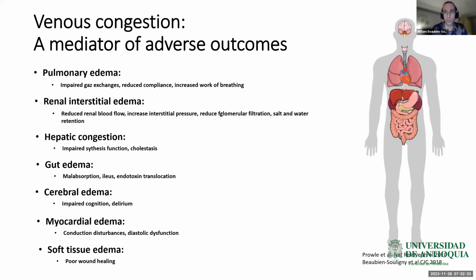However, when portal vein was normal at T1 and became abnormal after bypass, the risk of major complication was particularly high at 40.5%, whereas if portal vein was abnormal at T1 but normalized after bypass, the complication rate falls back to a rate similar to the normal pre and post bypass, at 23.7%, which was an interesting finding.